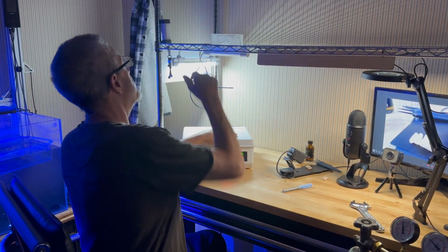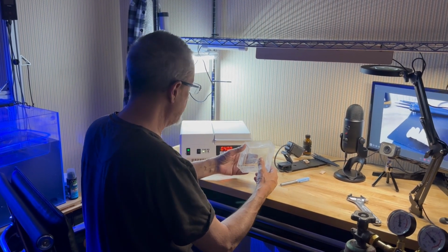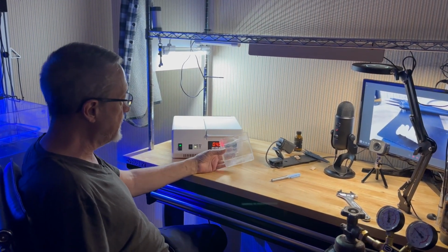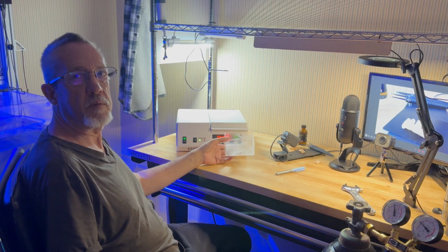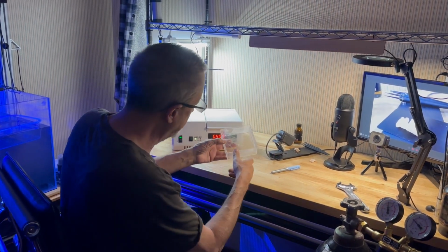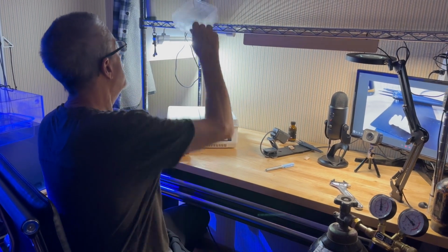The other thing to go over is these trays. One is a UV blocker, A or B. I don't know which one that is. I really didn't have time to look it up, and honestly, it doesn't really matter to me much until it does. One of the things it says clearly in the instructions is do not clean these trays with alcohol. We thought, okay, what could happen? Kim sprayed it and instantly it cracked from one end to the other, like movie magic. Just watch it crack all the way through. So that tray's destroyed. I don't know how much they are, but I can tell you they're hard to find.